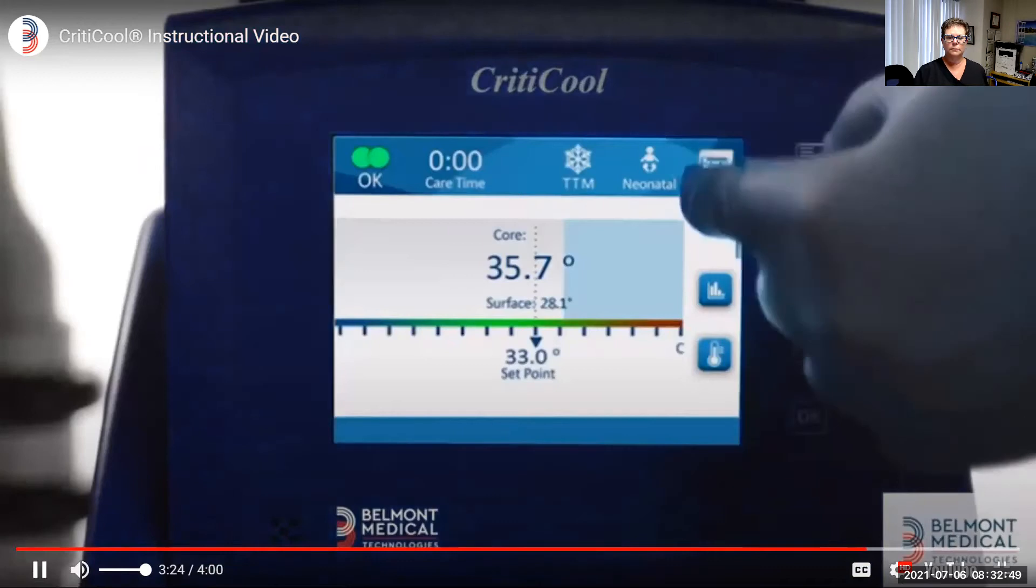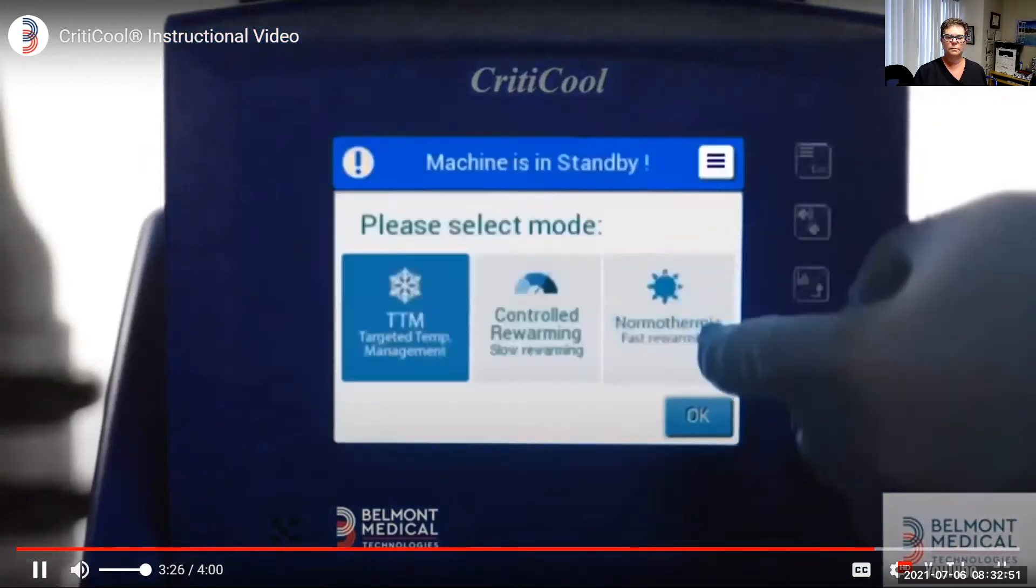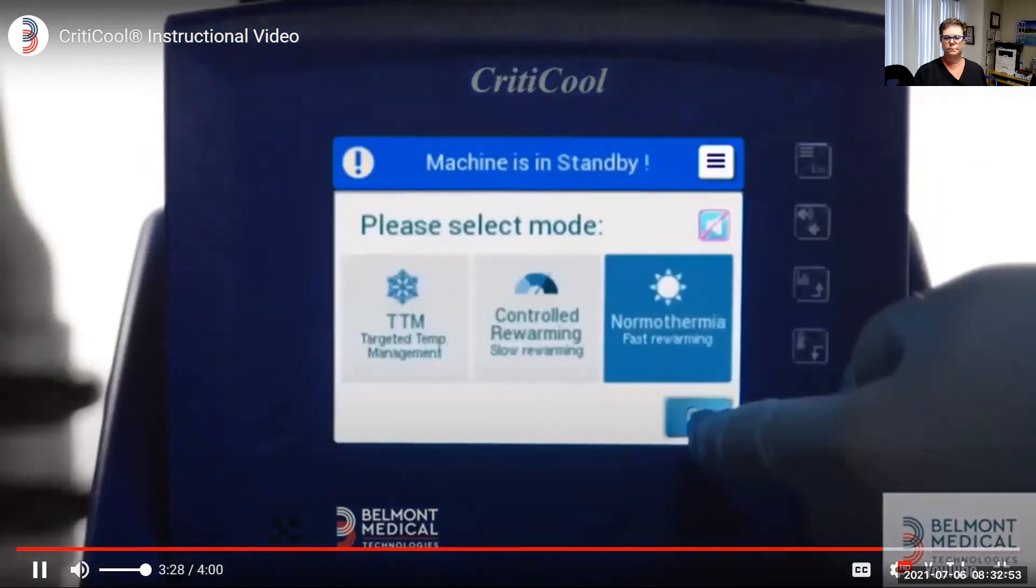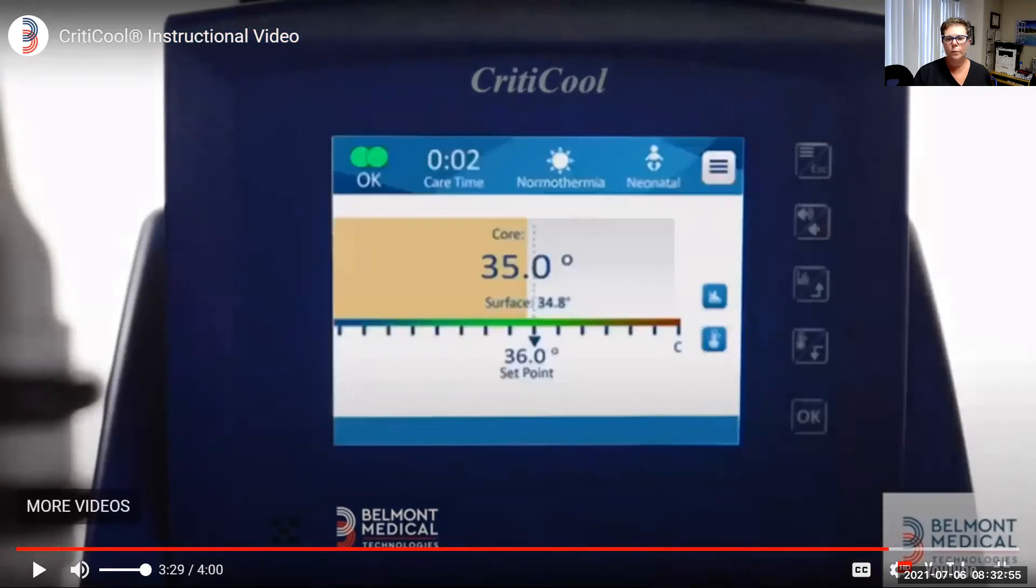Normothermia mode allows you to perform a rapid rewarming. The system will reach the desired temperature and keep it. We will not be using normothermia. That is indicated for patients likely in the emergency department that have suffered an accidental hypothermia. So it will not be a mode that we will use. So we will use targeted temperature management for the first 24 hours and controlled rewarming for the rewarming phase.